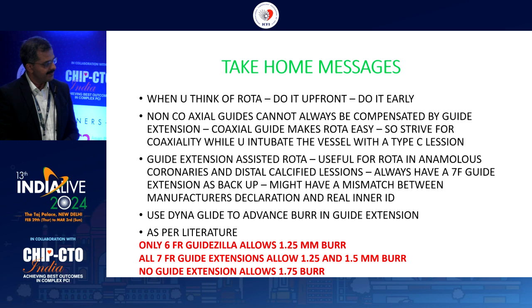You said the burr, when you were trying to get into the guide extension, damaged the guide extension, or the burr got damaged? Actually, we were trying to introduce it with the Dynaglide. It got stuck in the proximal part of the guide extension, and we couldn't move in either direction. So we had to take the guide extension and the burr out together, and both the burr as well as the guide extension were damaged. Any questions?